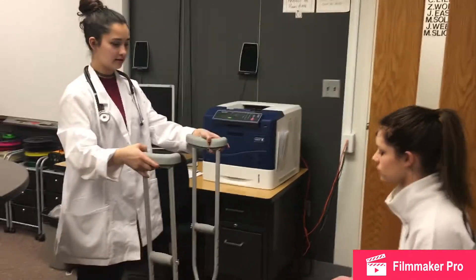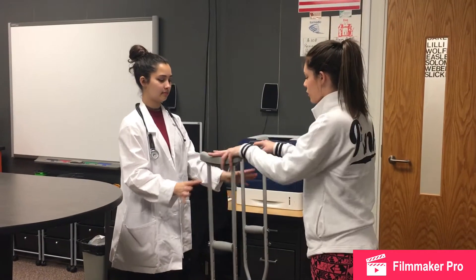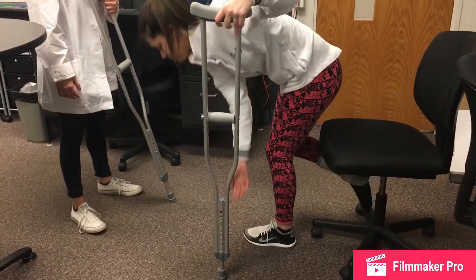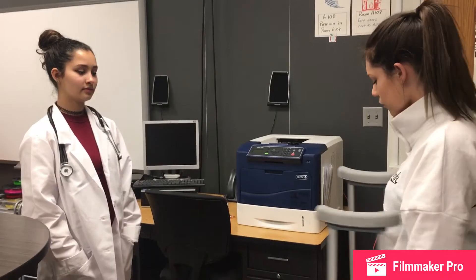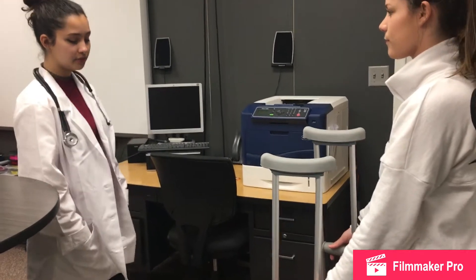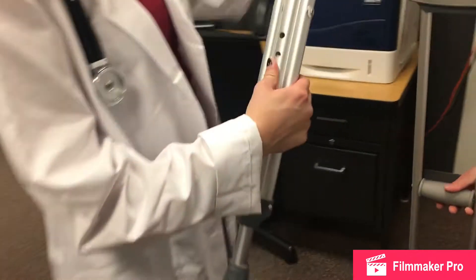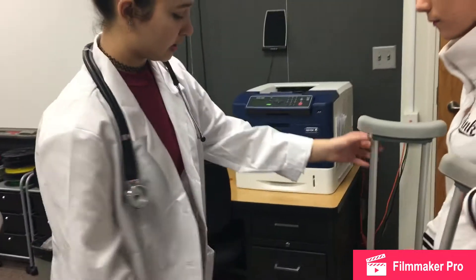Go ahead and stand up. So first we need to set these for your height. Well, I already know how to do it. Do these look alright? Well, there's a few things wrong with this situation. First, this one needs to be set for the correct height, which is 5'5. And let me check this one — this one's already set.